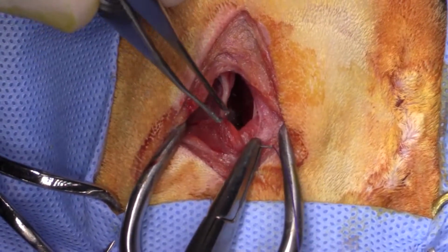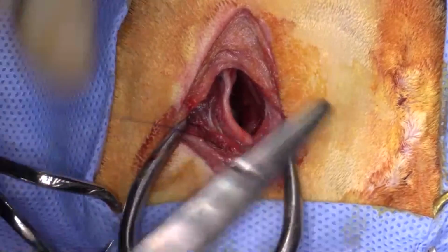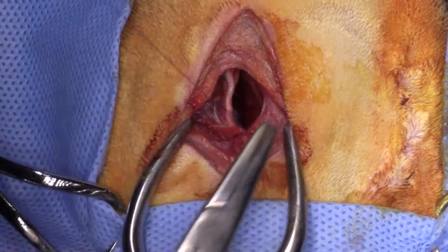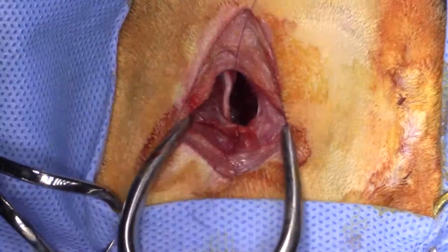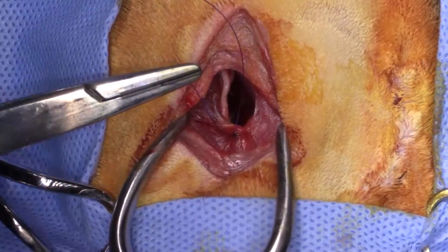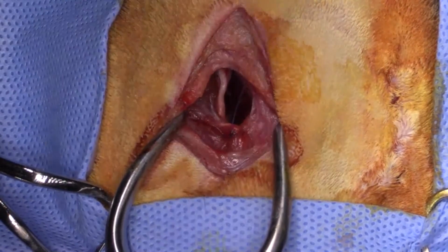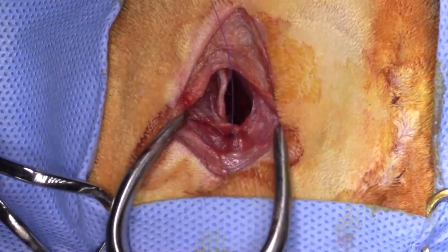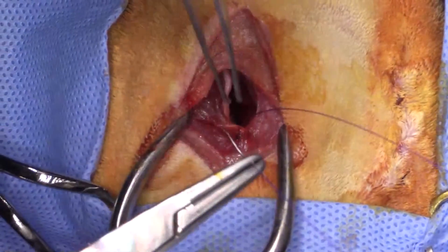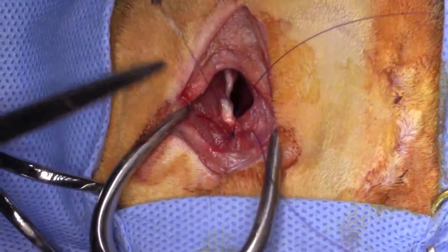Janine, we can start going over post-op. So no antibiotics on this guy. Discontinue the marbofloxacin. Well, who put, did the vet put it? Primary care vet. I'm happy to stay on that. Let me get some mitts. Run that suture for me, please. Yeah, the refit on that. We'll go ahead and finish that course.